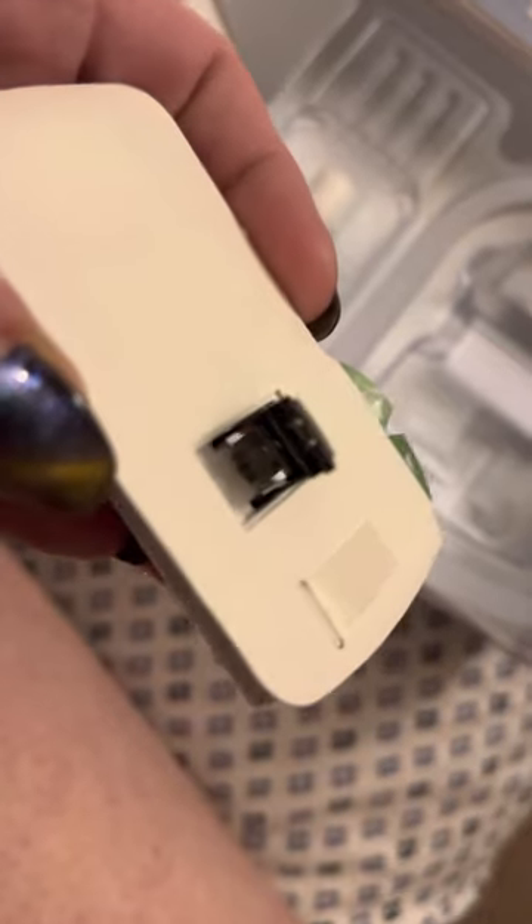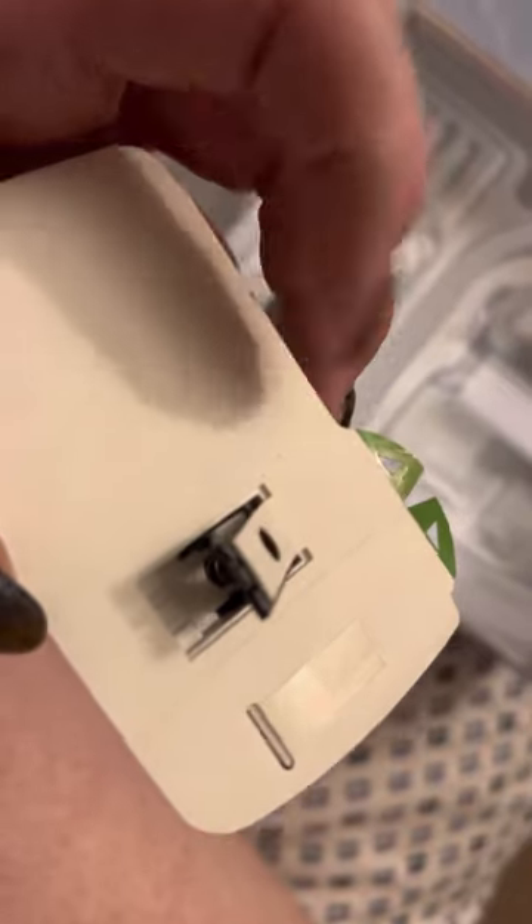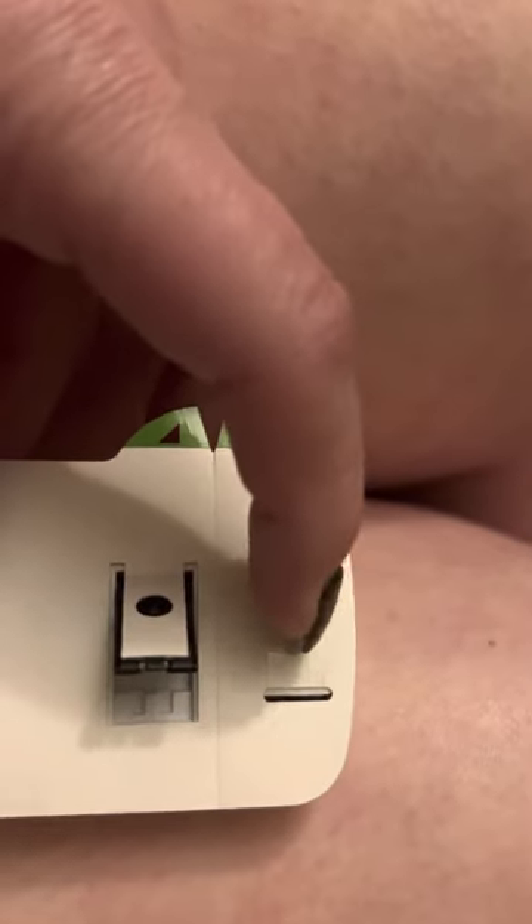I can't see because of the lighting in here, but just make sure that the needle is poking out — mine is. Make sure that when you're ready, you pull this big tab off first. If you pull this tab off first, it's going to pull out that little tab there and it's going to start the timer.